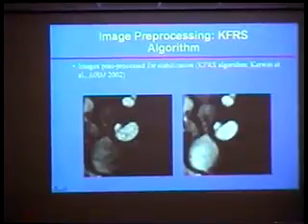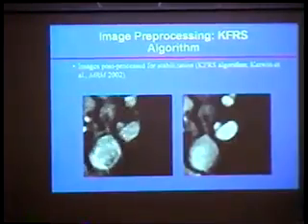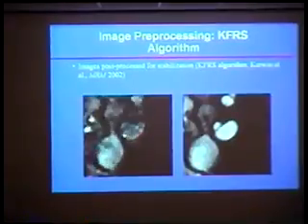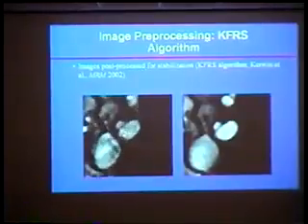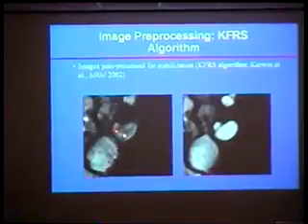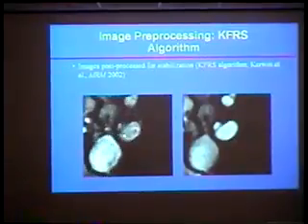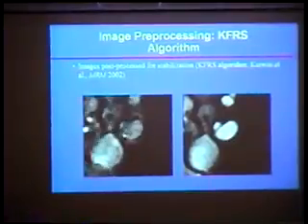But before we can use this dynamic data in an effective fashion, we have to deal with problems like this. This is how much motion you will see during injection. By the way, the patient is supposed to hold still. This is a 3-minute study, and this is the motion you see. Certainly, this is not a terribly good patient as far as keeping motionless. But we have to deal with this if we want to truly analyze the data.